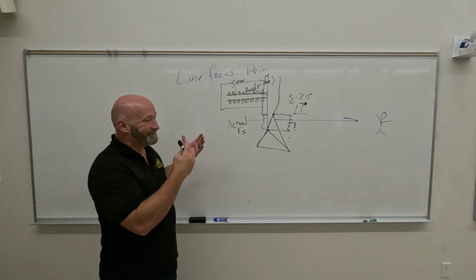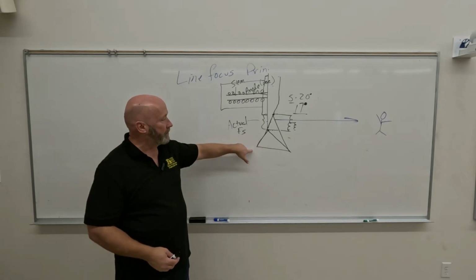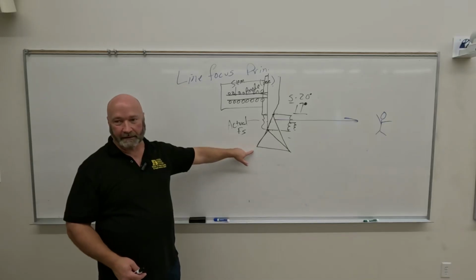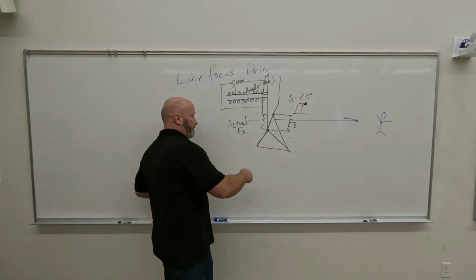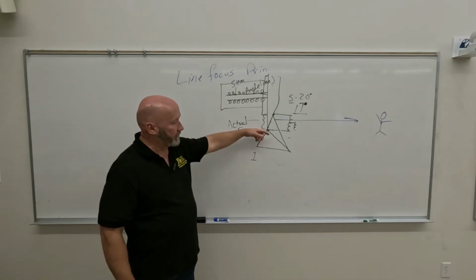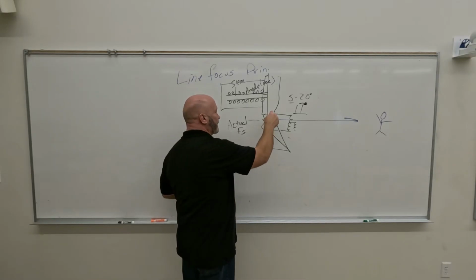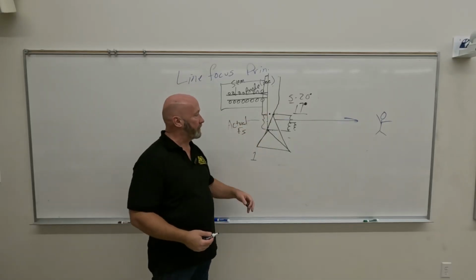So in this very crude drawing, how many X-ray photons did we emit between the one that had to penetrate the entire anode and the one that didn't have to penetrate that entire anode? How many X-ray photons did we get here? One. And over here, remember, X-rays are created right on the surface of the anode. It's not that they bounce off an atom halfway through the anode.